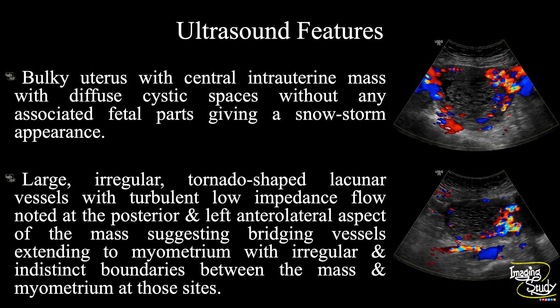In summary: a bulky uterus with a central intrauterine mass showing diffuse cystic spaces without any associated fetal parts, giving a snowstorm appearance, suggests gestational trophoblastic disease. Large irregular tornado-shaped lacunar vessels with turbulent low-impedance flow are noted at the posterior and left anterolateral aspects of the mass, representing bridging vessels extending to the myometrium with irregular and indistinct boundaries between the mass and the myometrium at those sites. These features confirm this as a case of invasive mole.